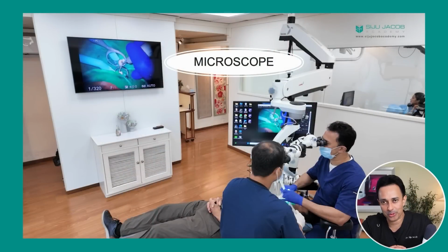First of all is the microscope. In our opinion, endodontics should always be done with a microscope. But if you don't have a microscope in your practice and you're stuck with a retreatment case, which means the case has already been treated once and you want to redo it, it's probably a good idea to refer it to someone who has a microscope. However, if you do have a microscope, then yes, all that we discuss now will be even more relevant, because if you can't see it, you just can't do it.